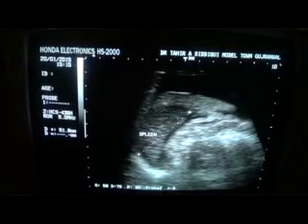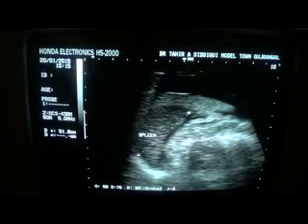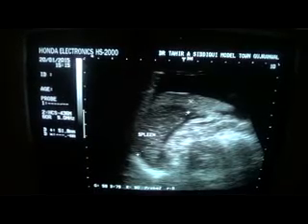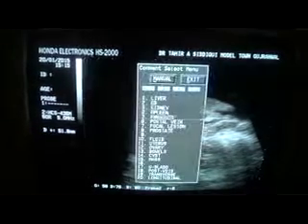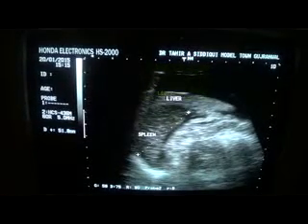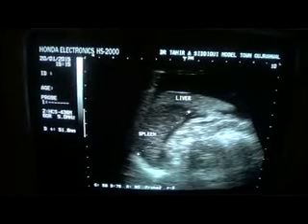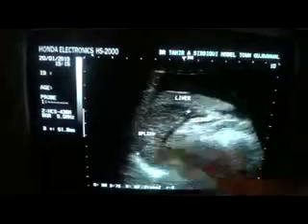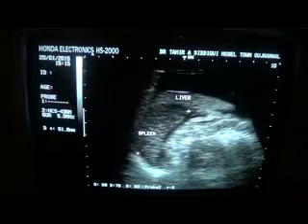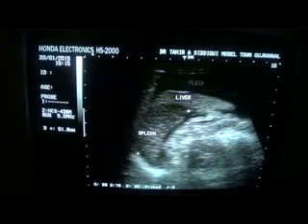So anyway, the spleen measures 5.1 centimeters, and this echogenic area is in fact the liver, and the liver is seen hugging the spleen. This white band of tissue is the liver, and the liver is hugging the spleen. The spleen, the liver, and all the rest of these are bowels, and this is the ascitic fluid. This is the fluid.